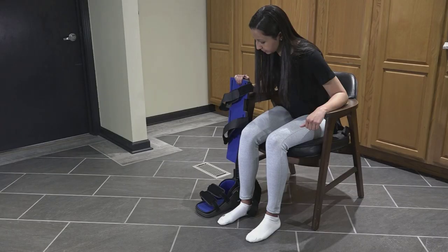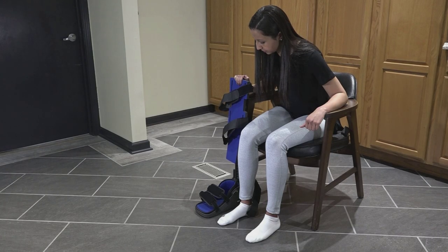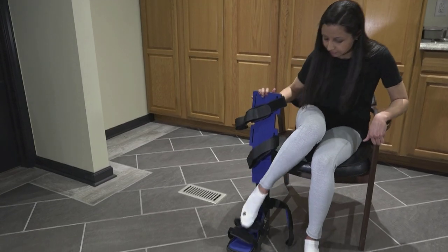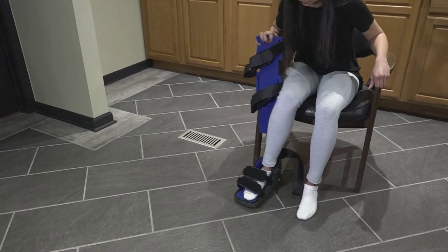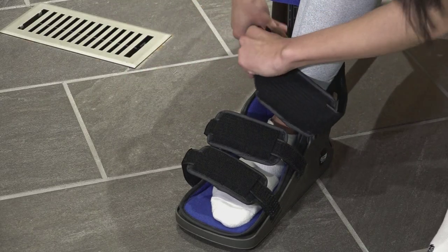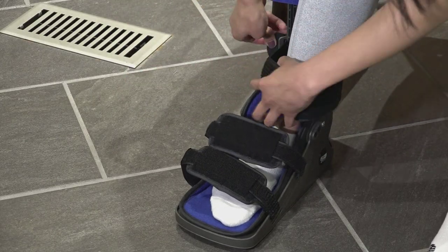You will want to start the process sitting in a chair, with feet on the floor and knees bent at a 90 degree angle. Insert your foot into the pre-threaded straps while keeping the extension post outside your leg. Make sure your heel is pushed all the way down.